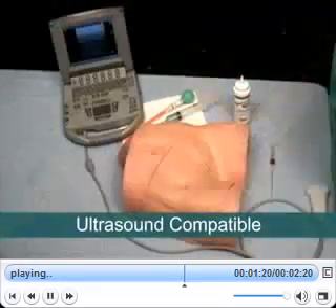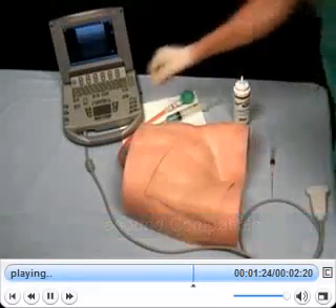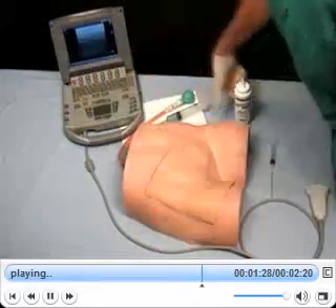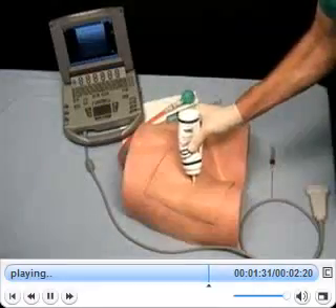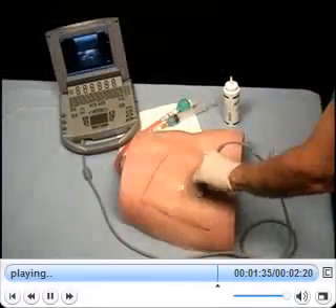An ultrasound imaging unit can be incorporated into this procedure. Begin by turning up the gain on the ultrasound unit and applying gel to the tissue before proceeding. Search and find the vessels on the imaging unit.